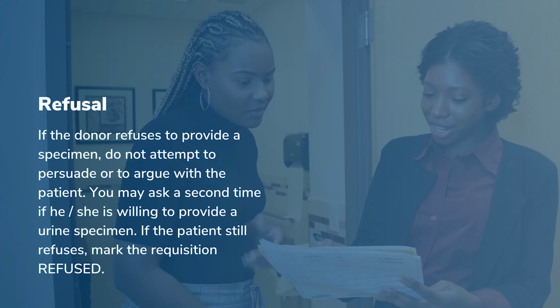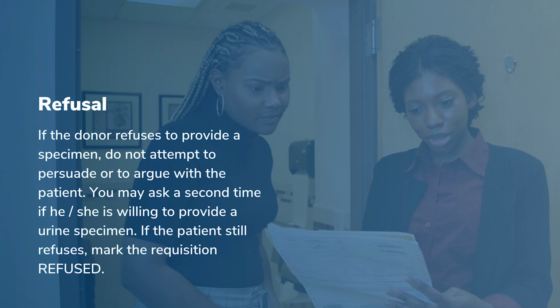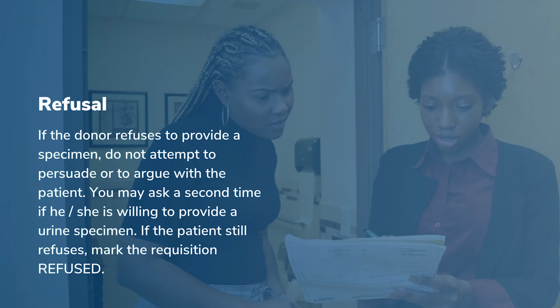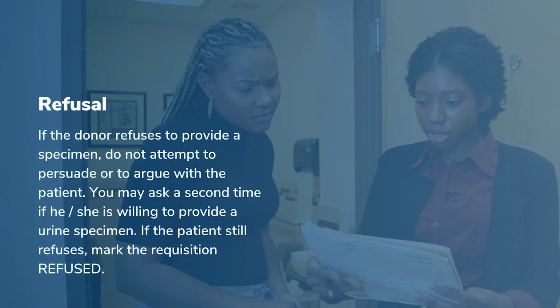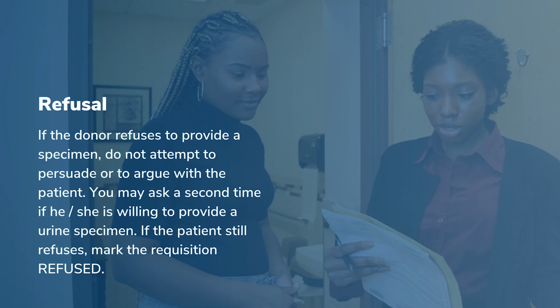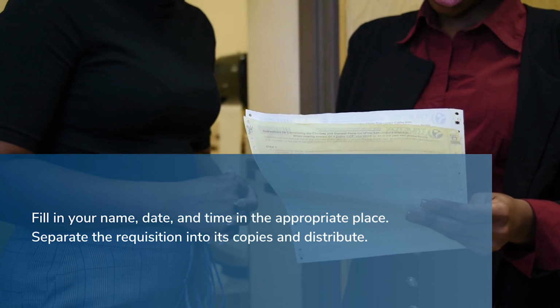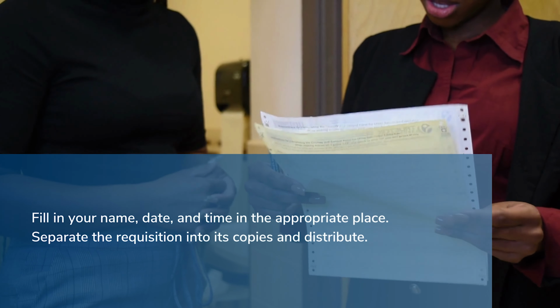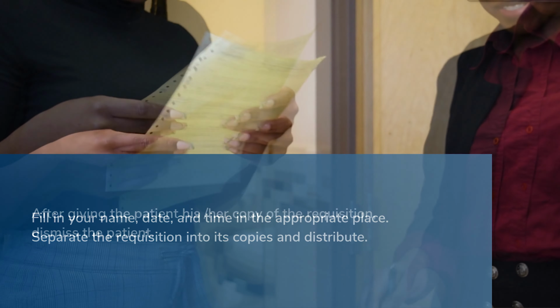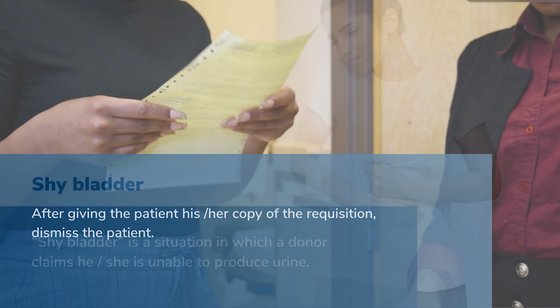Refusal. If the donor refuses to provide a specimen, do not attempt to persuade or to argue with the patient. You may ask a second time if he or she is willing to provide a urine specimen. But if the patient still refuses, mark the requisition refused. Fill in your name, date, and time in the appropriate place. Separate the requisition into its copies and distribute it appropriately. After giving the patient his or her copy of the requisition, dismiss the patient.